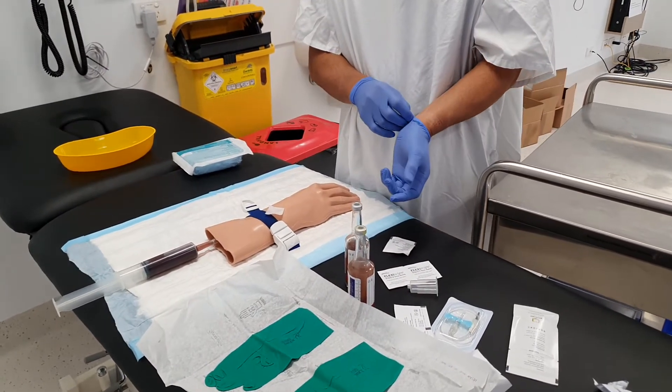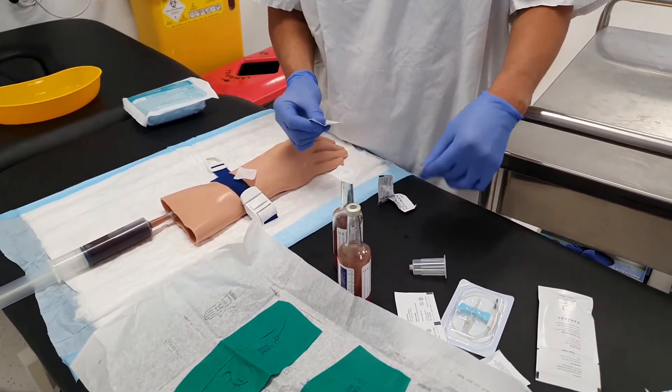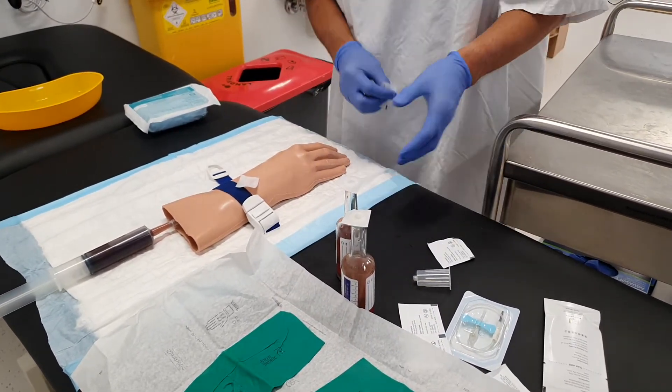The blood culture bottles — I like to flip the lids off them, which is what you're supposed to do. I've seen some pathology departments actually put the alcohol swabs over the top of the bottles once you flick them.